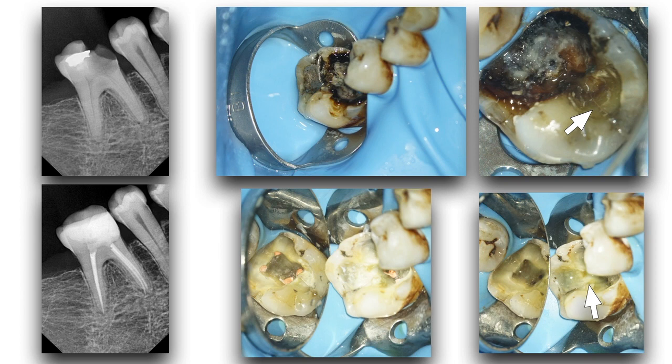Let me tell you that when I see amalgam inside the tooth, in a very rare case, we are not seeing a crack. Here we have a case that reached the pulp. The case needs root canal therapy, but I know that sometimes when I have such cases, I have a crack. Maybe this crack goes inside the root.